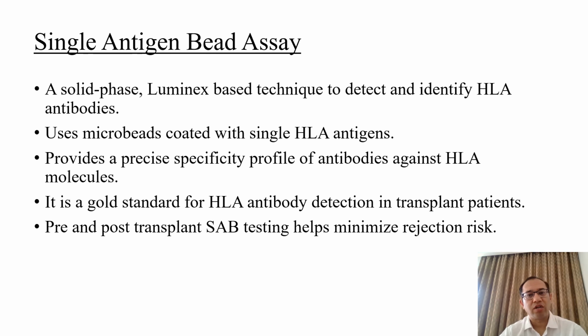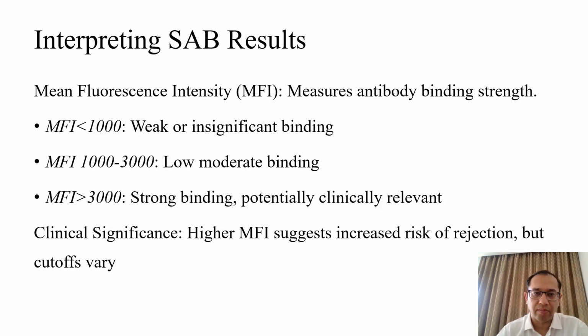So it is done basically on a single antigen bead assay. This is a Luminex based technique in which each bead is coated with one HLA antigen. So that gives you a precise specificity profile of the antibodies against the HLA molecule. It is a gold standard for HLA antibody detection. It is the most sensitive and most specific test that is available.